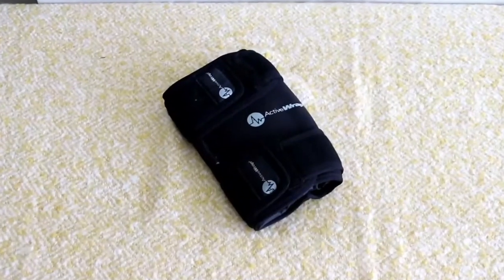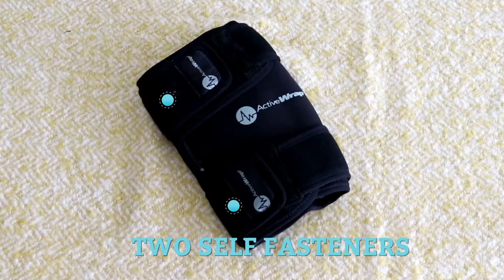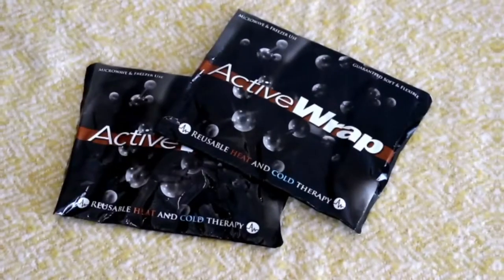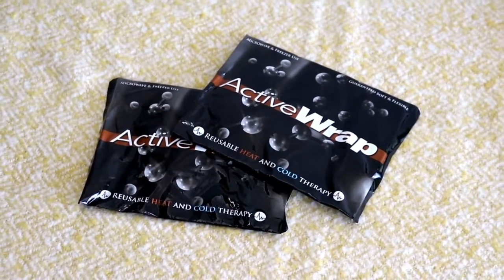Looking closer at the wrap, you'll see that it's secured by two self-fasteners, which are quite easy to attach and remove. A knee wrap is only as good as its gel packs, so we're glad that Active Wrap's gel packs didn't disappoint. In fact, these bad boys make Active Wrap really special.